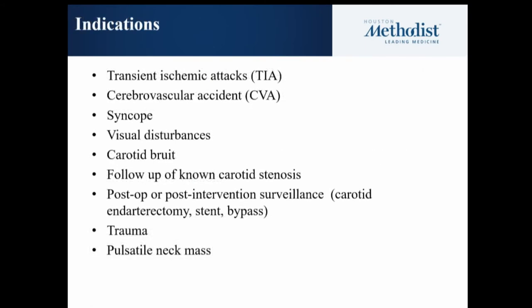Our indications for the exam are TIAs, strokes, syncopal episodes, visual disturbances, carotid bruits, any follow-ups on known carotid stenosis, and of course, post-intervention surveillance after endarterectomy, stents, and bypasses, any trauma to the neck, and any pulsatile masses.